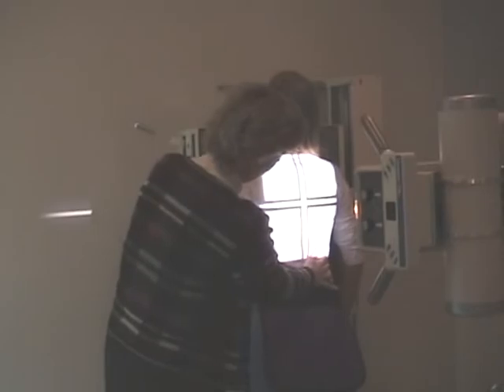Mid-sagittal plane to the center of the film. Feet spread for stability. And then just look and make sure you're getting the affected side on there, and we are. So I'm going to live with that mid-sagittal plane to the center of the film. Left marker on this side, I put on the cassette. Okay, and then she can just relax. Just make sure the arms are away from the board a little bit.